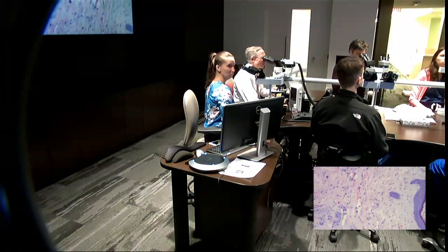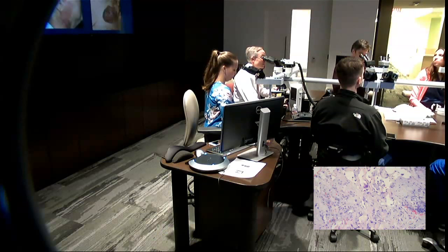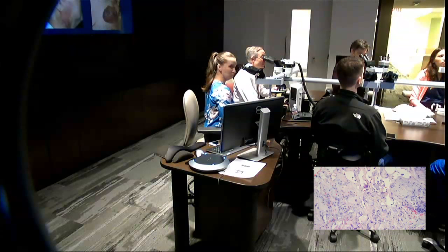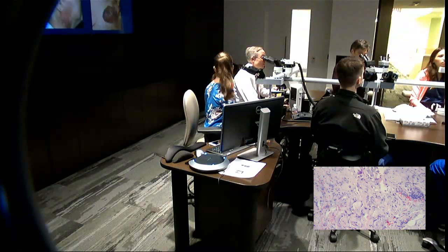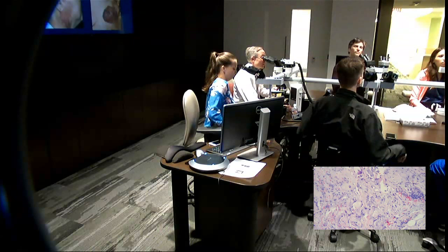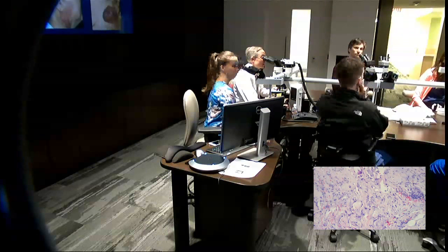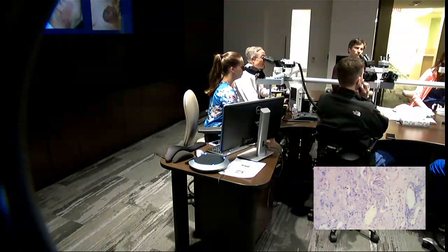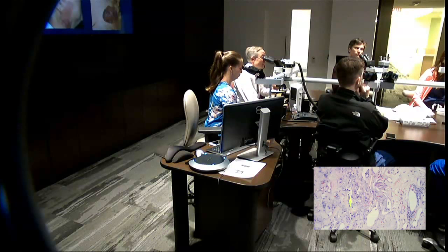So with angiosarcoma, there are several types. If you were going to subtype this, what would you call it — well-differentiated, poorly differentiated, or moderately differentiated? I think this is well-differentiated, and yes, it is well-differentiated.